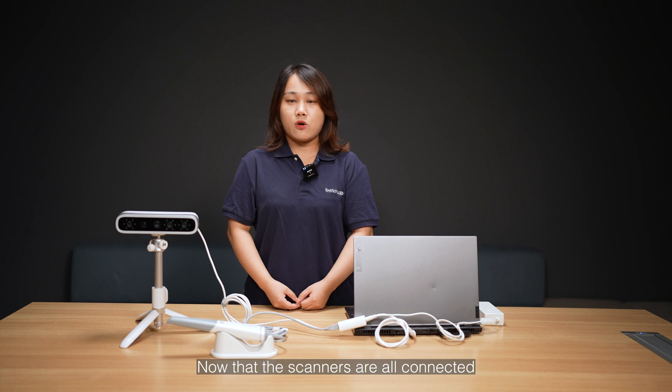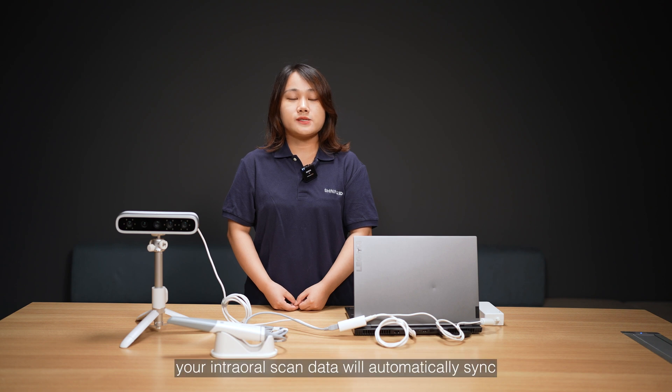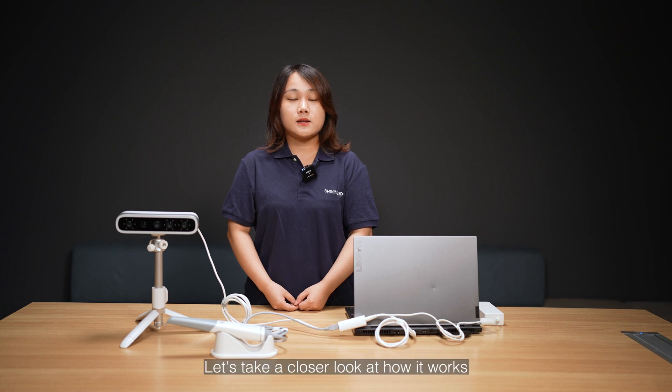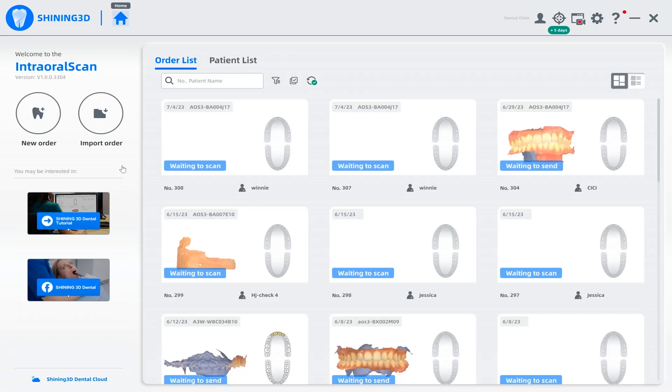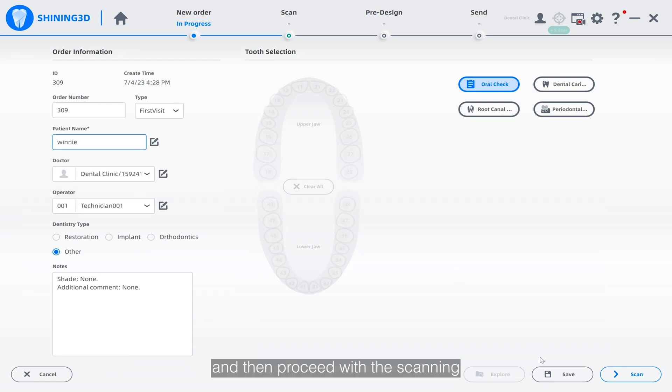Now that the scanners are all connected, let's focus on the software. By using the same cloud account, your intraoral scan data will automatically synchronize with the Matti Smile software. Let's take a closer look at how it works. We open the intraoral scanner software and create a new order as usual, and then proceed with the scanning.